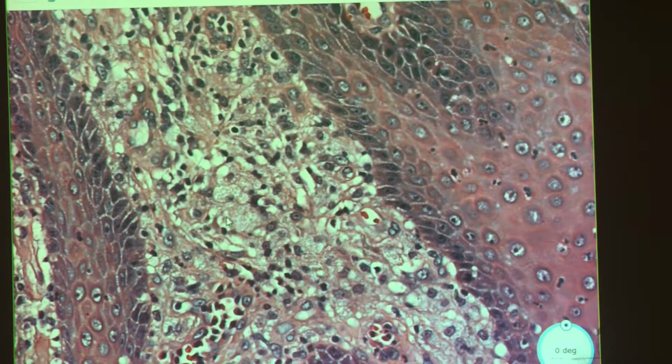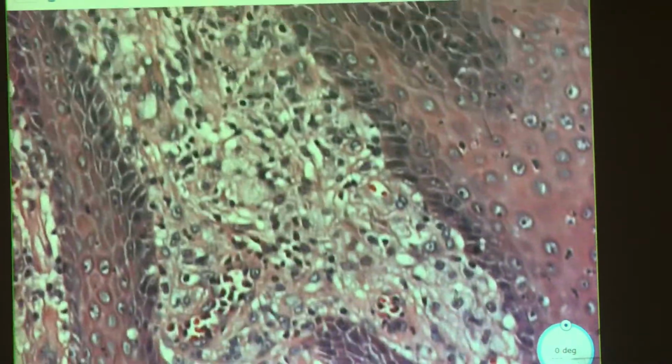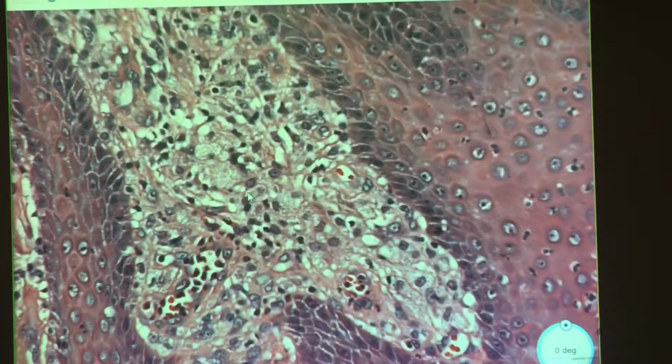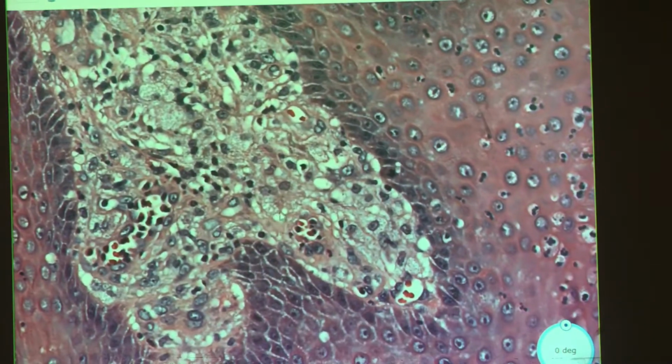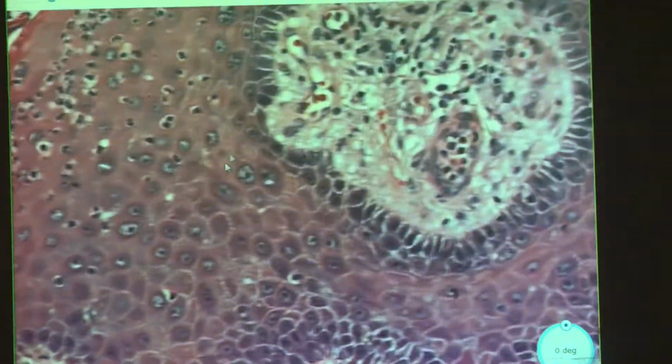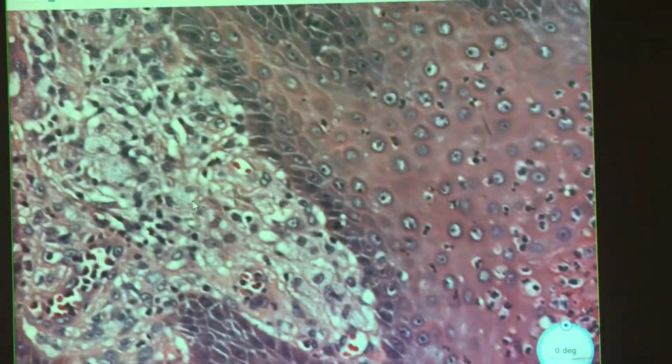Is that foamy? They're foamy. Yeah. Ah, it's pushing it up. I thought it was deeper. I thought they're extending, not being pushed up. Yeah, well, pushing up, extending, but like that's what's in between, right? So that's really like your lesional area and everything around it. This one really gives it the appearance of a verruca. And it even has the dilated capillaries.